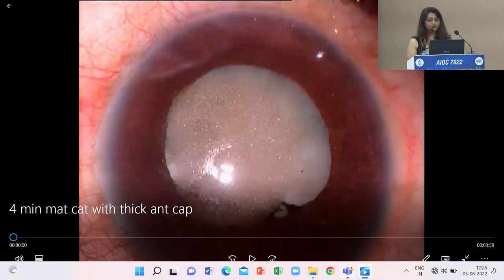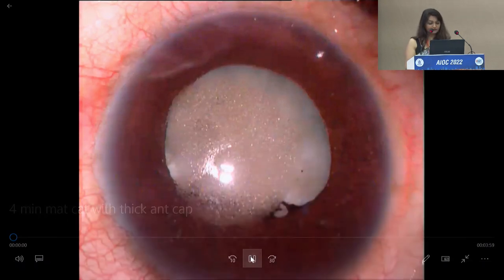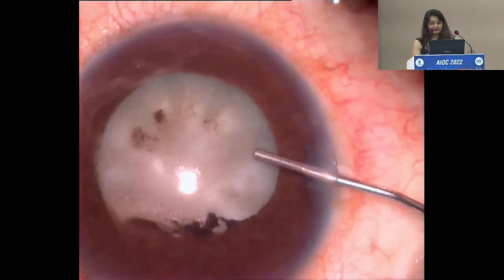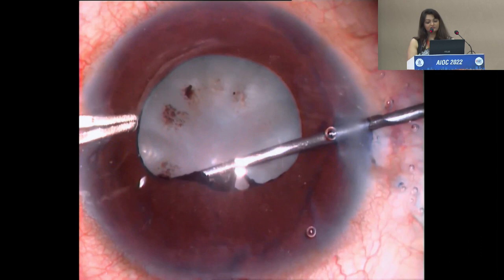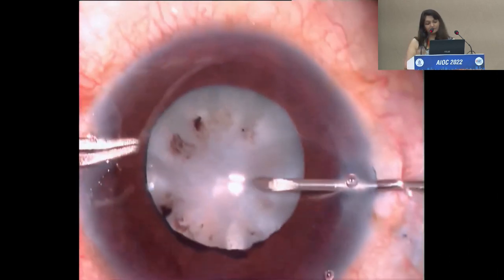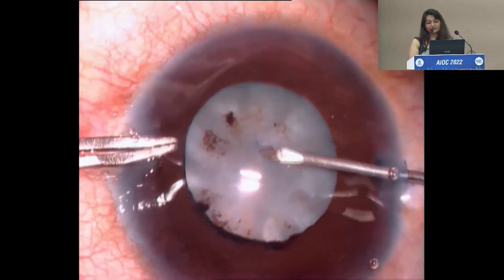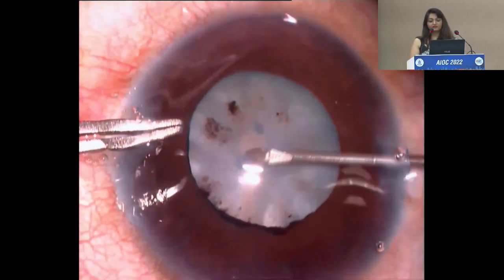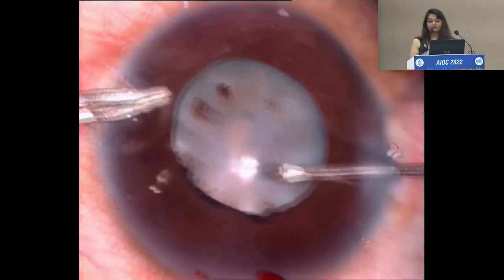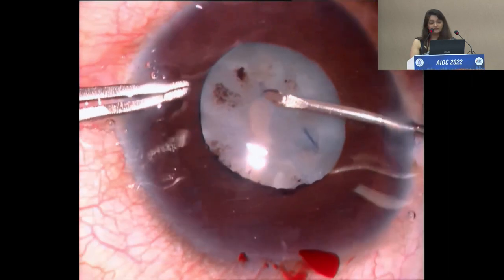A very good afternoon to everyone, and thank you, Dr. Harshul, for including me in this wonderful session. I thoroughly enjoy it. So this was my case, which had undergone pars plana vitrectomy. Silicone oil was out. As you have seen, I removed it, stained the capsule, released the posterior synechiae, and started my rexis. When I started, I realized that the zonules were very weak, the capsule was fibrous, and it was very, very difficult for me to move ahead with the rexis.